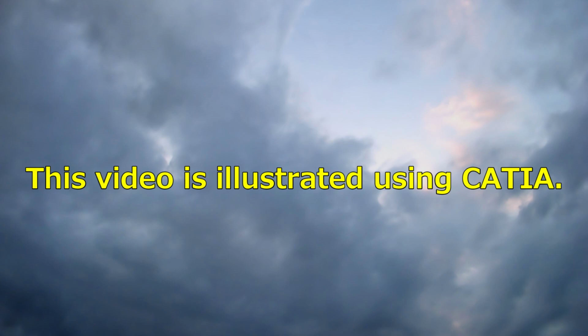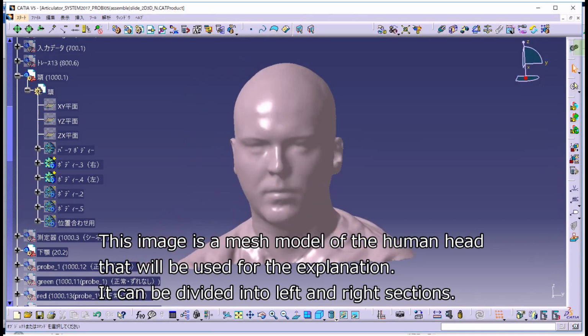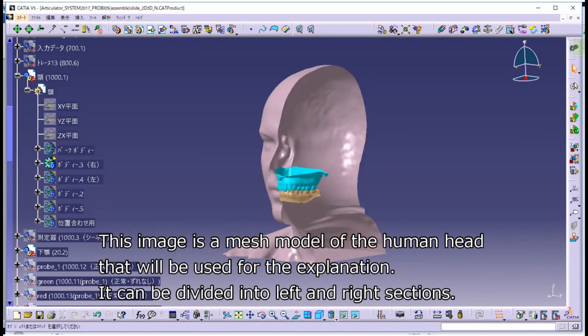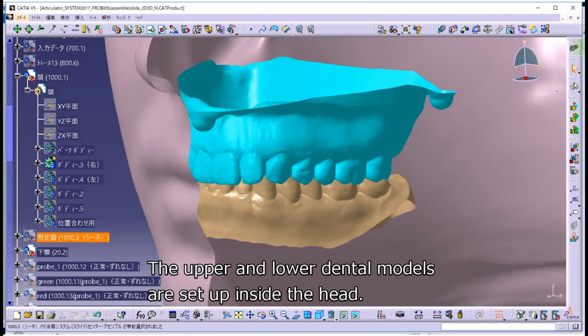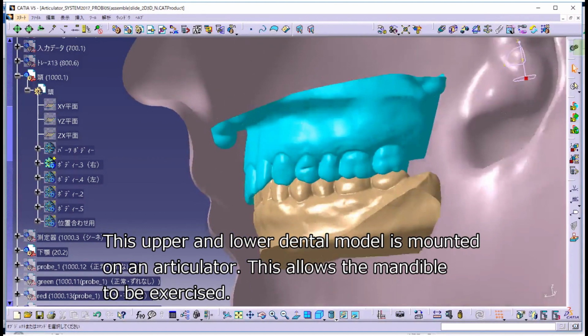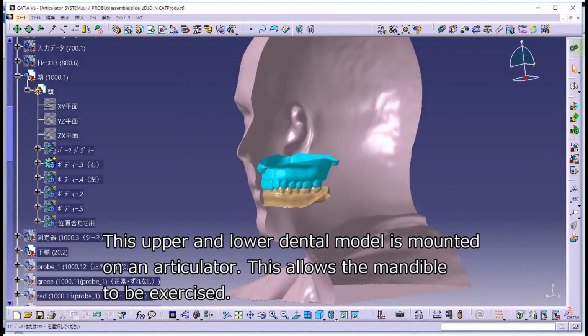This video is illustrated using CATIA. This image is a mesh model of the human head that will be used for the explanation. It can be divided into left and right sections. The upper and lower dental models are set up inside the head. This upper and lower dental model is mounted on an articulator. This allows the mandible to be exercised.